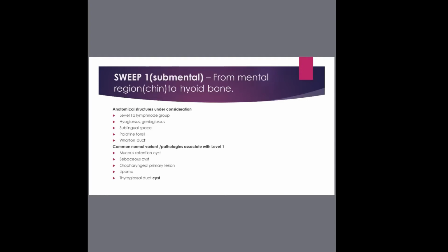Usually they don't have internal flow on color Doppler, which brings me again to this point that you cannot do head and neck ultrasound without color Doppler. You cannot do a thyroid scan without color Doppler. Because with things like thyroiditis, it is only Doppler that can tell you that this is classical thyroiditis, not just the echotextural appearance. With thyroiditis, you see inflammation, you see hypervascularity or a moderate increase in vascularity. So it is very important that you take note of those things.